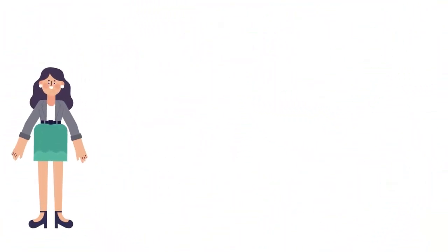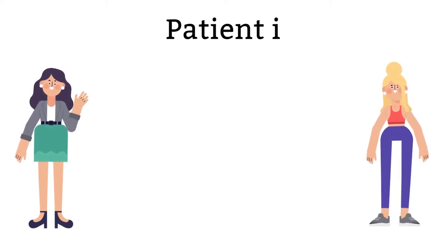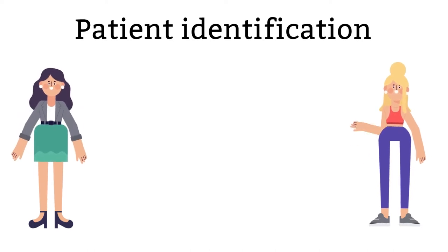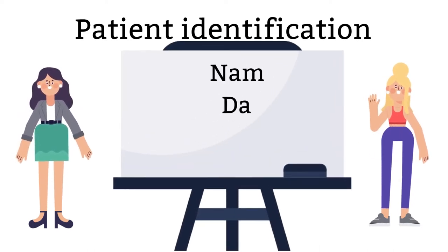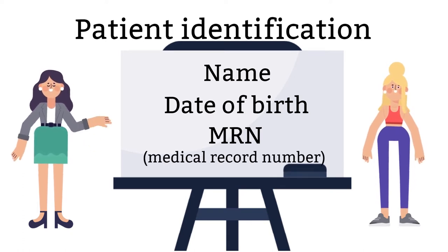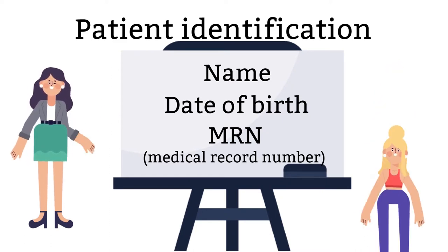After you have identified yourself, you will have to identify the patient. Correct patient identification is key to patient care. Wrong identifications can lead to wrong diagnosis and wrong treatments. Ask the patient for their full name and date of birth or medical record number. Do not forget to check the patient armband if you are drawing an inpatient.